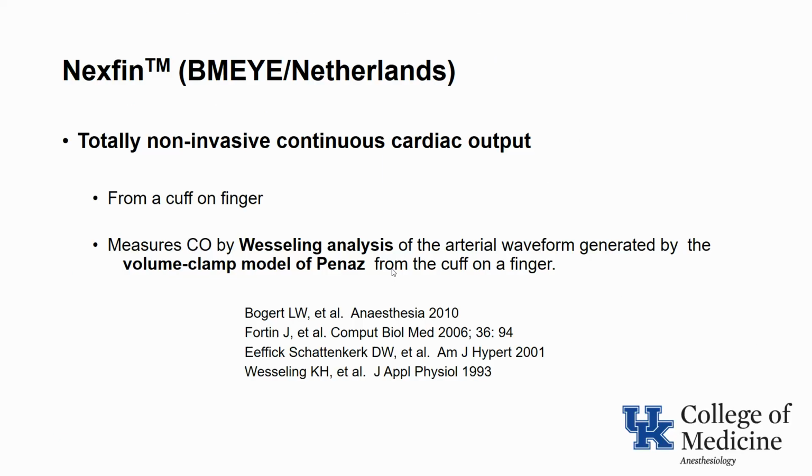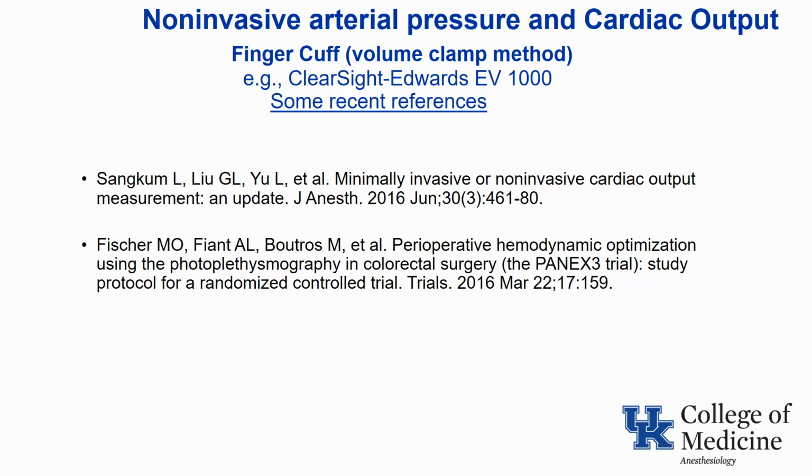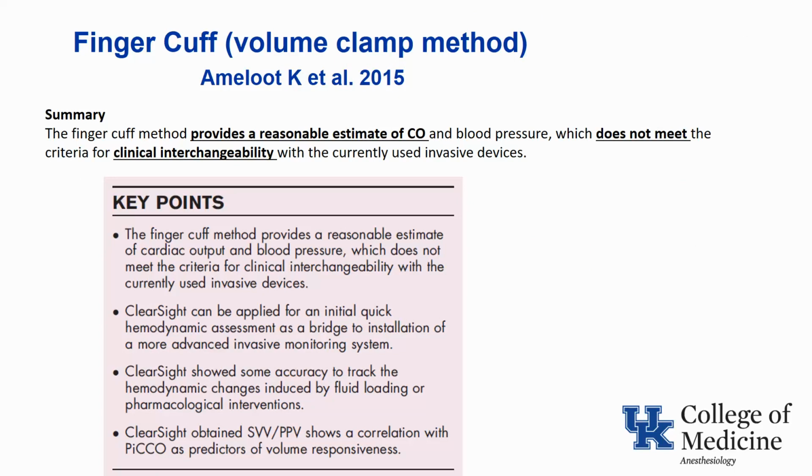Again, I mentioned that the finger system has been used to measure cardiac output, as demonstrated on this slide. And again, I've provided some recent references on this technique.